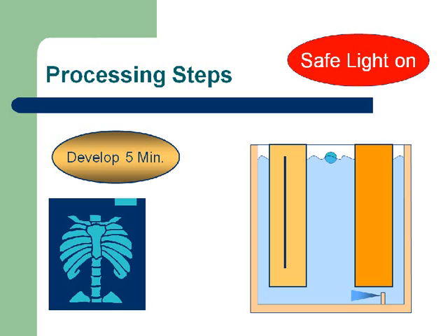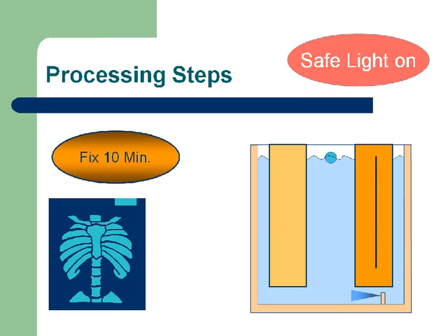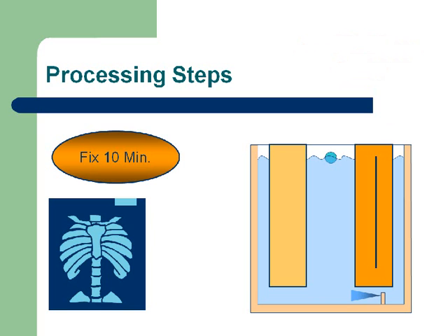We're going to leave the film in the developer for five minutes. Developer temperature is 68 degrees. Now we're going to move the film from the developer over into the fixer. As soon as the film reaches the fixer, you can turn off the safe light. Everything from this point on can be done under standard white lights.